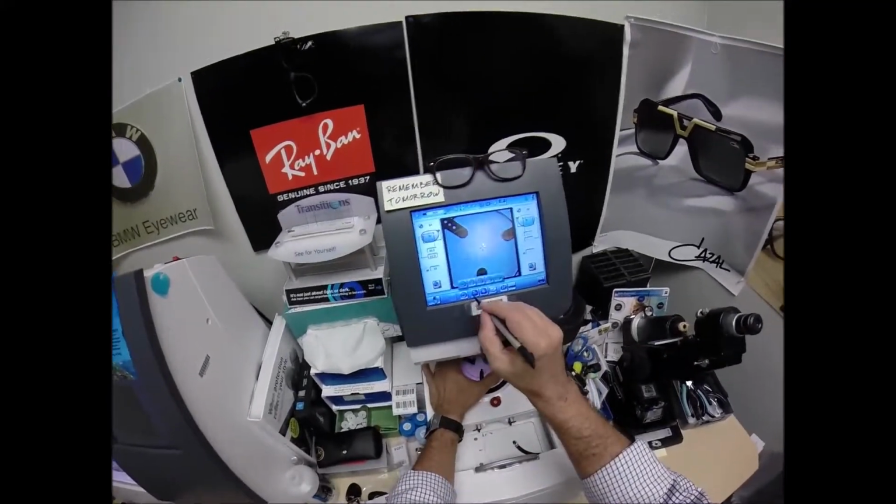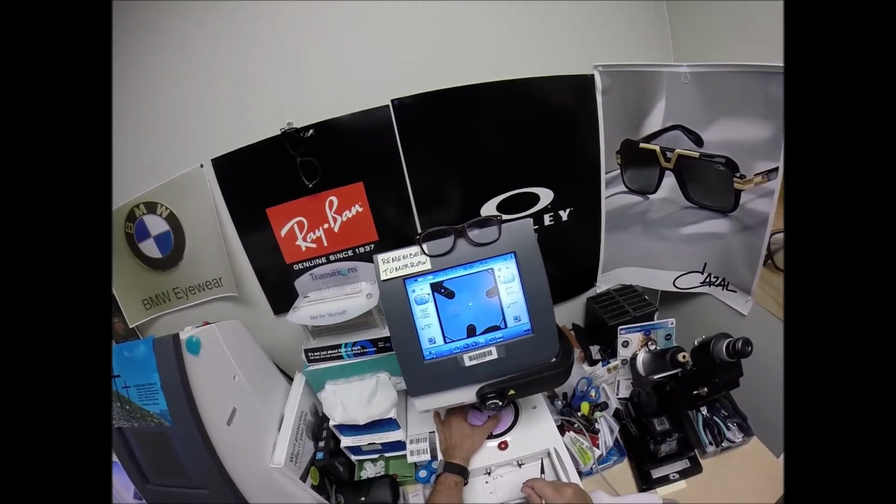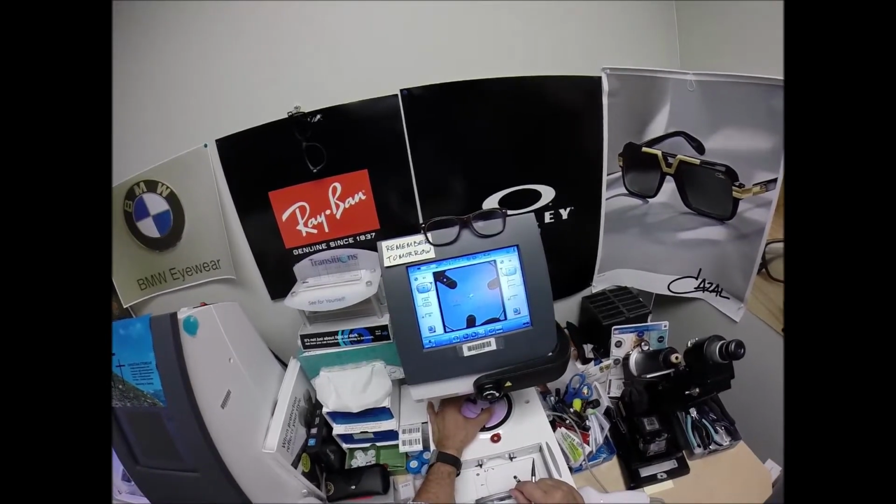And I got to change the screen from single vision to progressive. This is the no line bifocal, no line trifocal, multifocal. It goes by a million names.